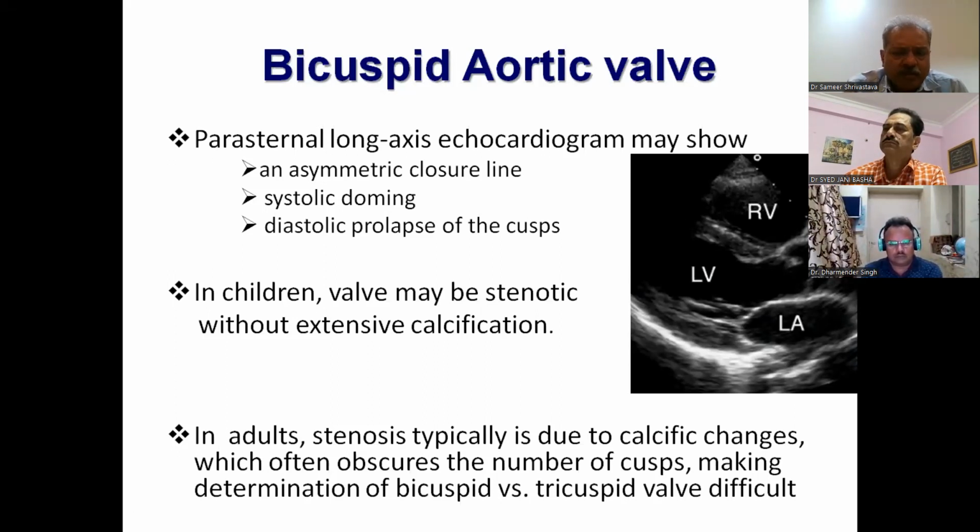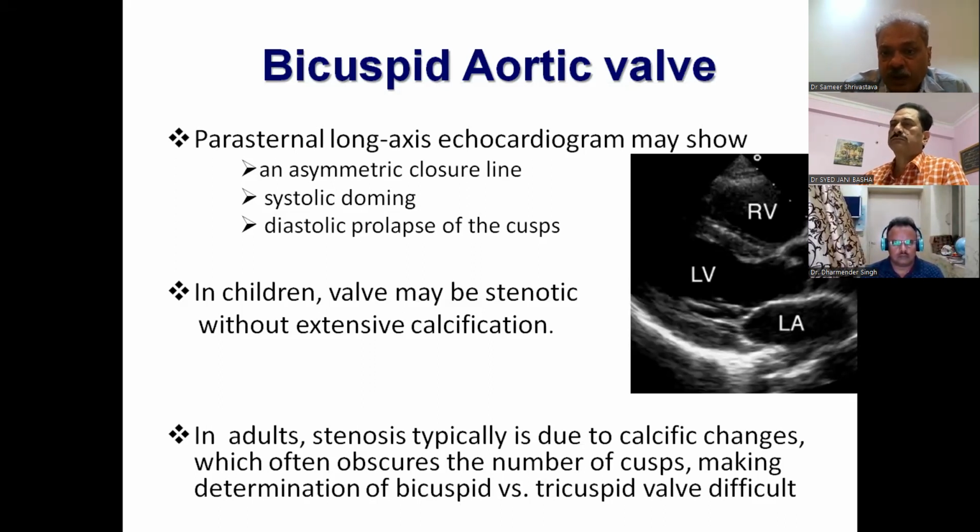To give you an example, if you have a mitral stenosis, you can't use it for a normal valve. Pressure half time is a formula which all of us are so heavily dependent upon, but we can't use it for a normal person. For me, if you take my pressure half time, you'll record my mitral valve area as maybe 2.5, which qualifies to be a stenotic mitral valve. So how do you know that it is a stenotic valve?